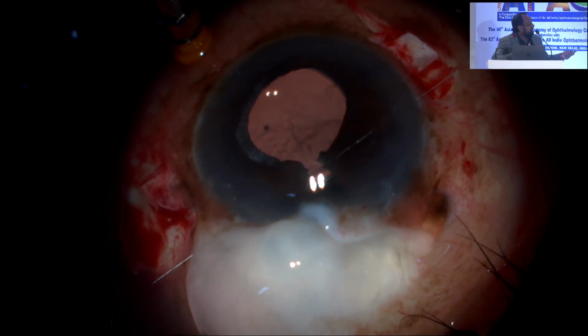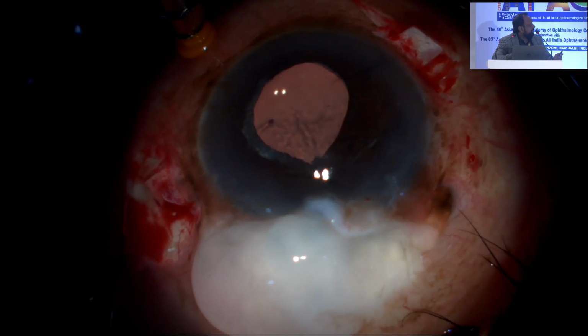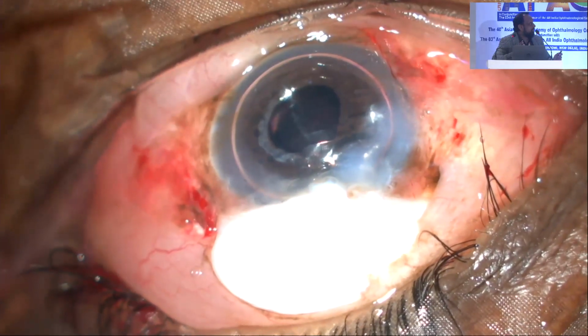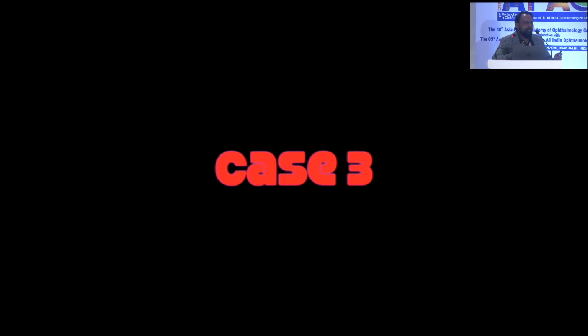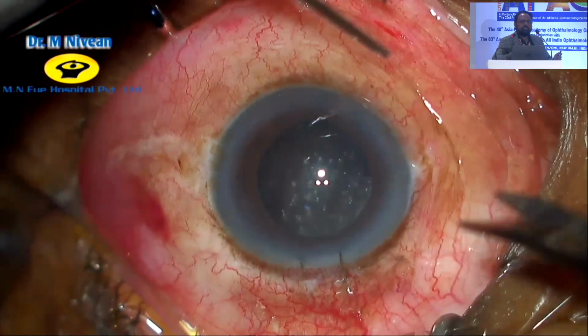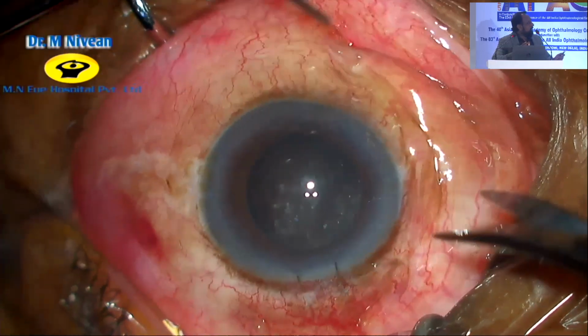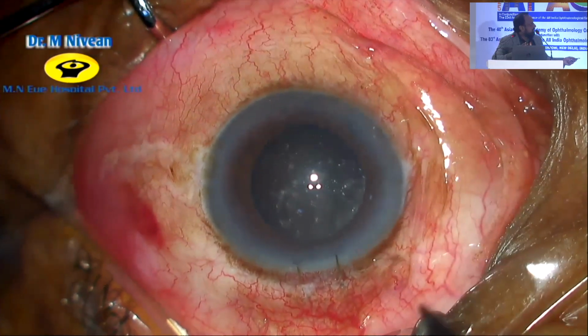And then we did an SFT for the superior iridodialysis. Yes, for the anterior segment surgeons, it can be done. It's an alternative again. So the last video is going to be that. The only thing is, always use an AC maintainer, because for any of these secondary IOLs, the biggest problem is hypotony. So this again, you can see a post complication of SICS in an asteroid hyalosis case.